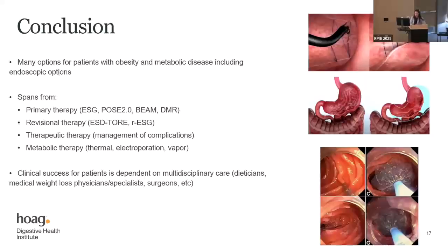In metabolic therapy, we currently have three possible duodenal resurfacing technologies, two of which will be undergoing randomized controlled trials. And I can't end this enough without saying that this is one of the only procedures we'll talk about today where technical success does not equal clinical success. Bilal can do a POEM and 100% of his patients will have clinical success.